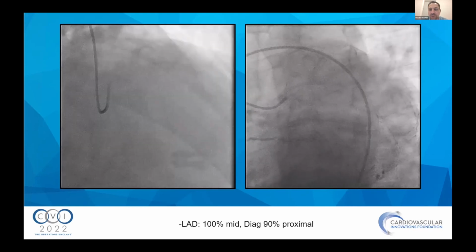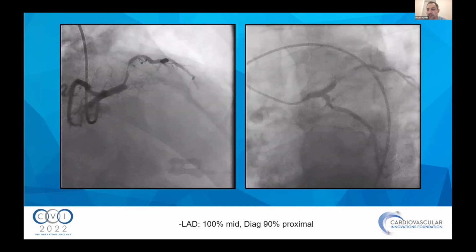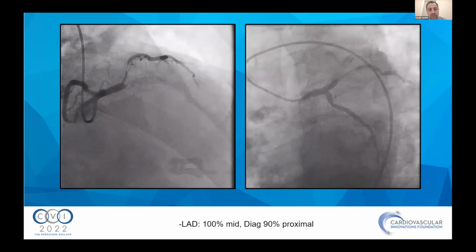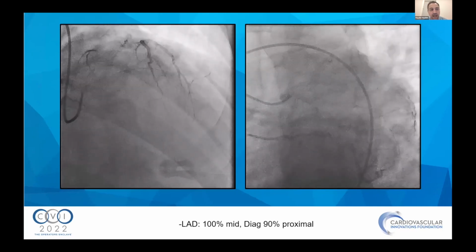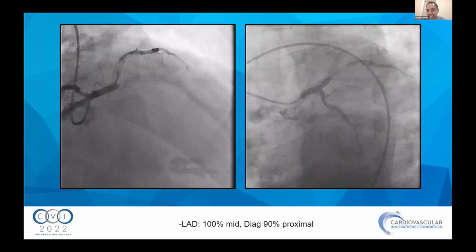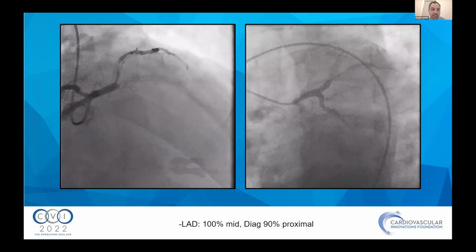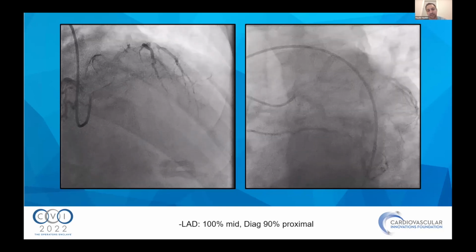I'll probably present him to the surgeons just to get the blessings. If they deny him, then we will have to think. The problem is, Manos, he already demonstrated ISR. That makes his second layer of stent a bit challenging, but sometimes your hands are tied.